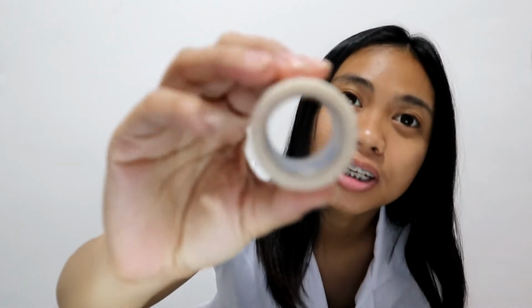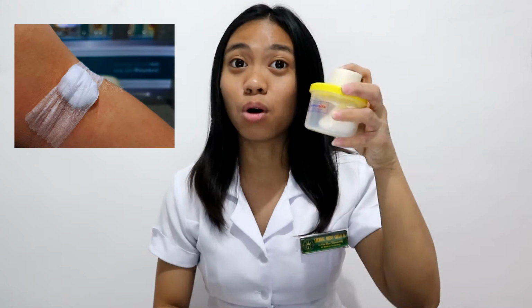Today I'll be using a red top tube, glass vacutainer, which has no clot activators, no anticoagulants, no preservatives, and no separator materials. In short, nothing. Lastly is tape, specifically micropore, and dry cotton that come hand in hand. These are used for covering the puncture.